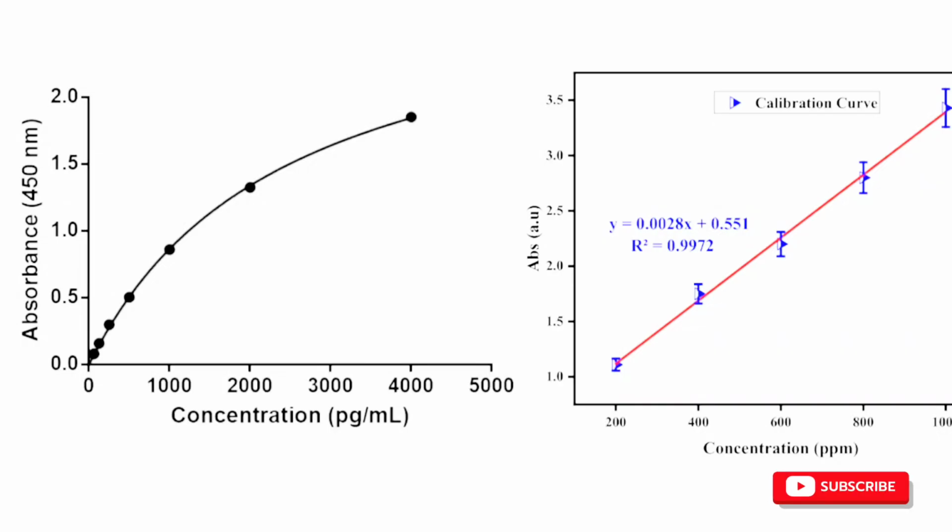Does that make sense? Okay, so that is why, when we talk about linearity, like I've mentioned, you are trying to determine a patient result or analyte result. You are trying to determine a result using this very specified range, which is within this place to that place, or within this absorbance to that absorbance.